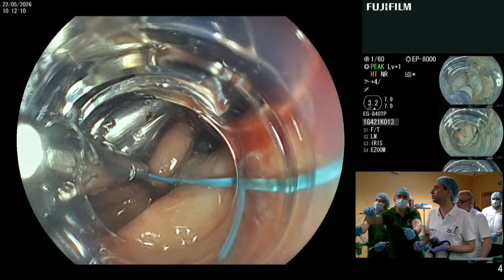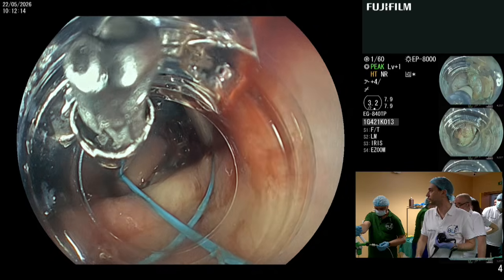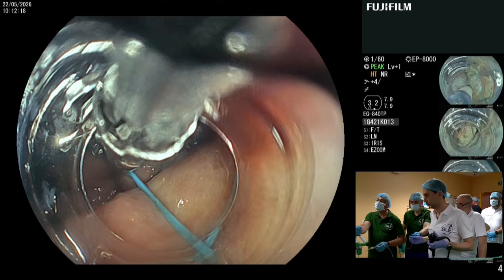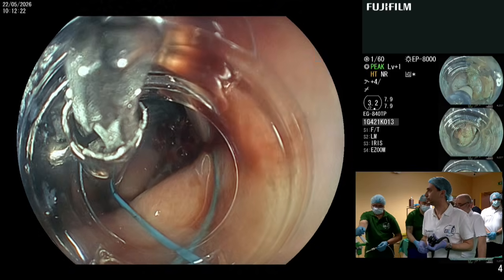Probably two more. And now I can grasp, yes, these two sides and we're done. Yes.